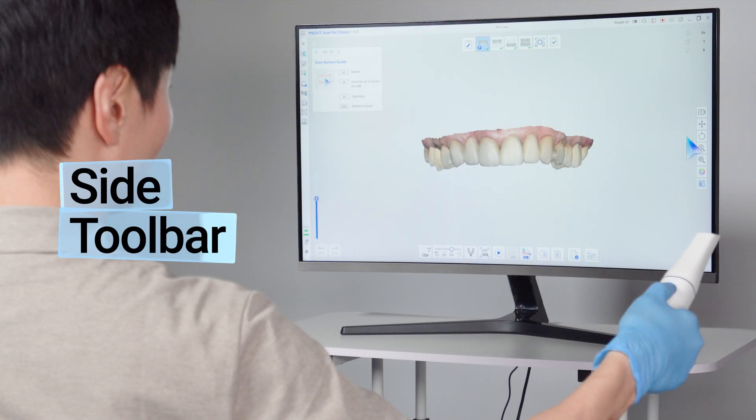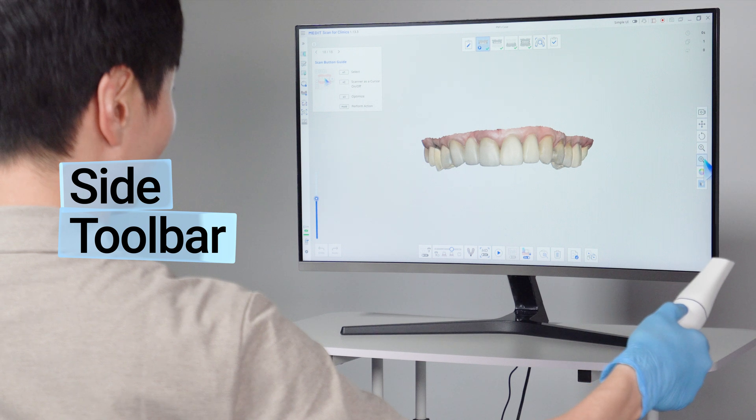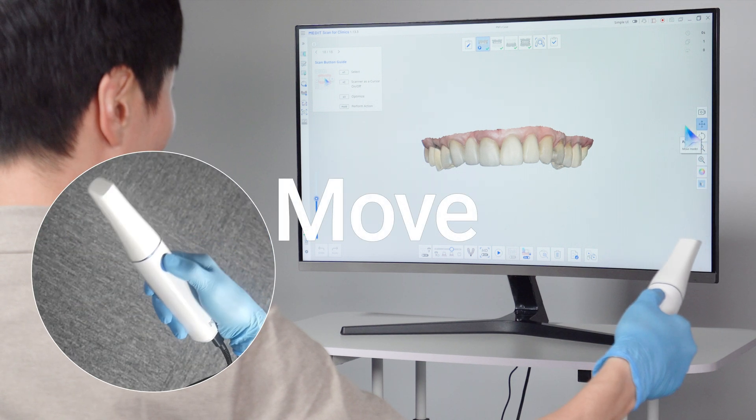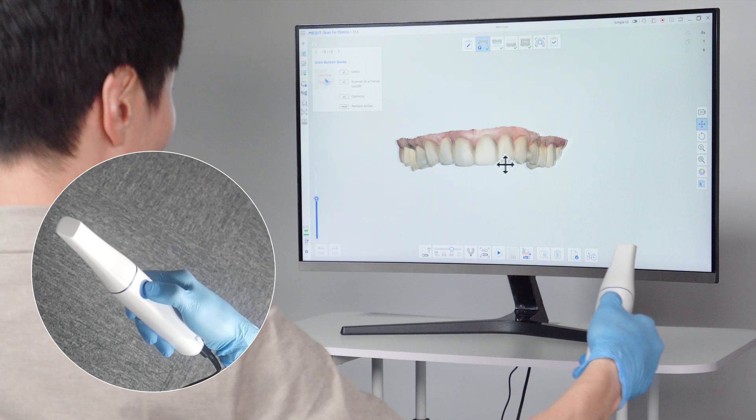Double-click, move the scanner to the side toolbar, and select tools to control data. To move data, click the pan icon, then hold down the button and move the scanner.